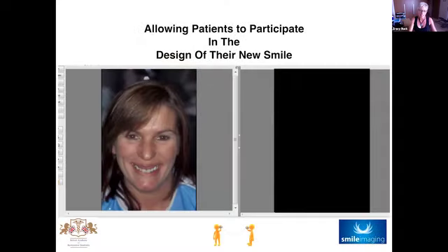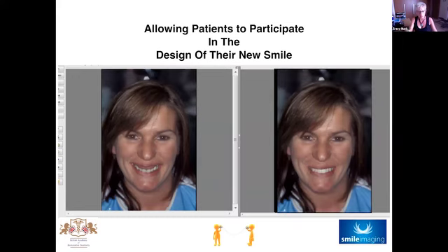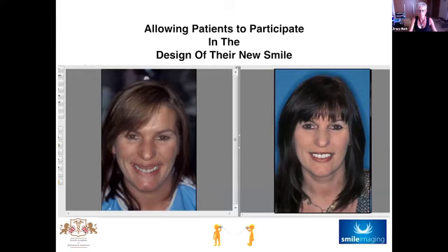But for this lady, obviously Paul used the imaging to show her a clear idea of how we could change her smile. So with Paul communicating that to us, we can then also send the photos to the laboratory, again, to stop breakdown in communication. And then obviously here's the beautiful case that Professor Tipton's created for the lady, and you can see, wow, what a difference that is and how pleased she was with that.